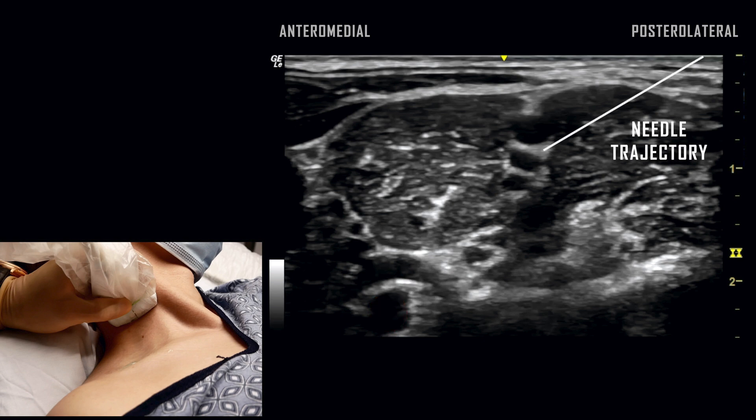The needle tip should be directed from lateral to medial in between the nerve roots to avoid accidental nerve root injury. A subtle pop is elicited as the needle passes through the prevertebral fascia.